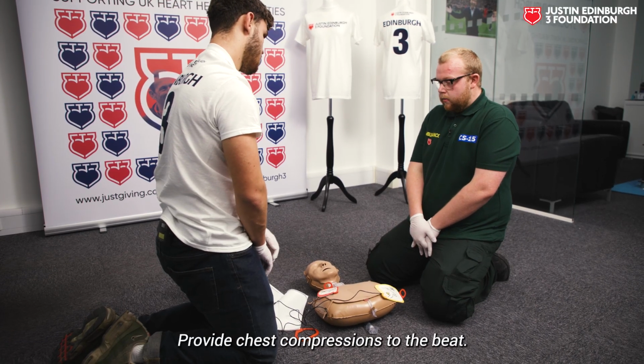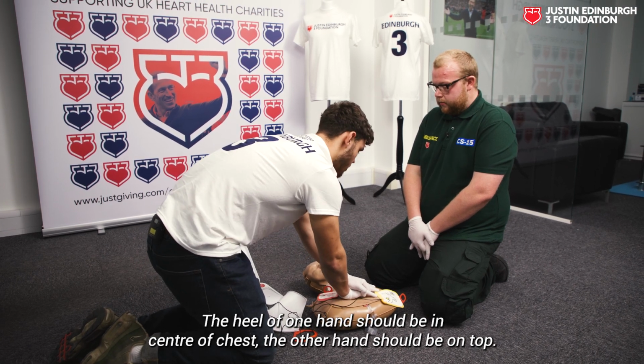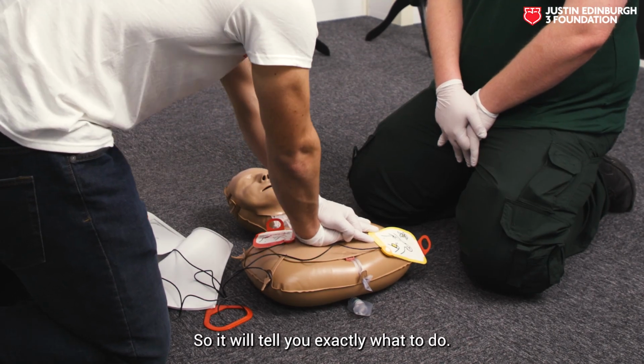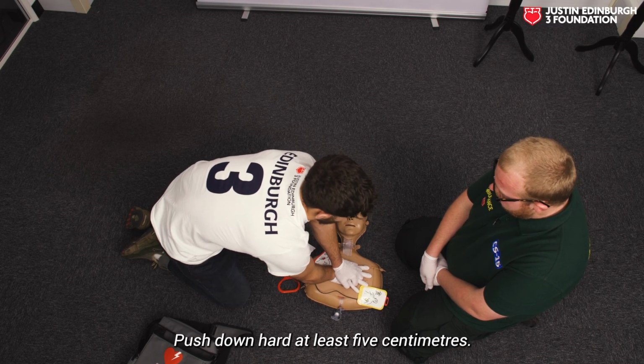Provide chest compressions to the beat, and then whenever you're ready. The heel of one hand should be in the center of the chest. The other hand should be on top of that. So it tells you first exactly what to do. Push down hard at least 5 centimeters. Perfect.